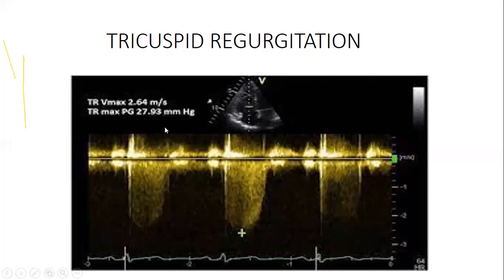It's slightly increased pulmonary hypertension, because we know that the right ventricle systolic pressure is equal to the pulmonary arterial pressure. So just from here, I'm able to quantify how much pressure is within the pulmonary artery. I'll just add around 10, or 8.